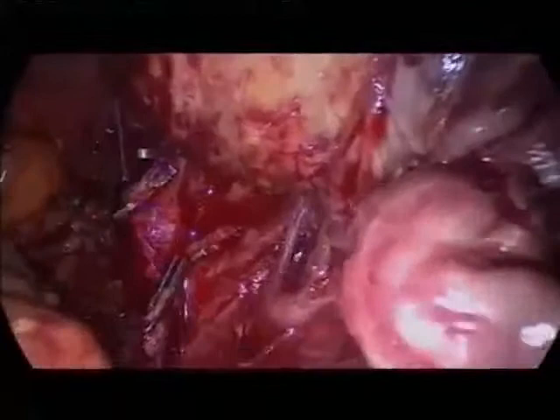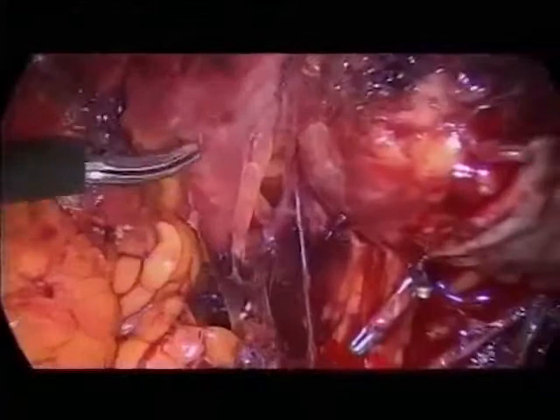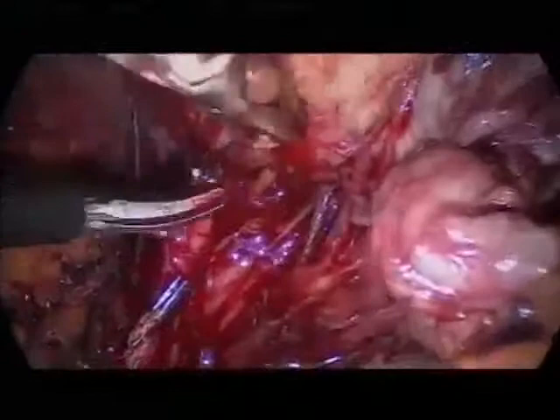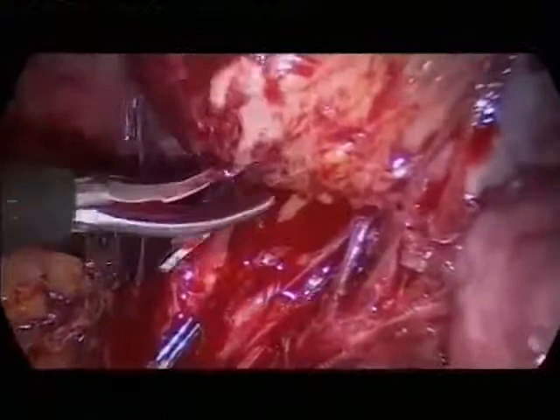Two levels, from medially, laterally. You see here, this is periprostatic fascia. It's very nice to see. And this is endopelvic fascia. So here, under this, is the rectum. So we connected, let's say, this level with this level. And I think this is very helpful. I would not say it's a must, but it's very helpful for orientation.